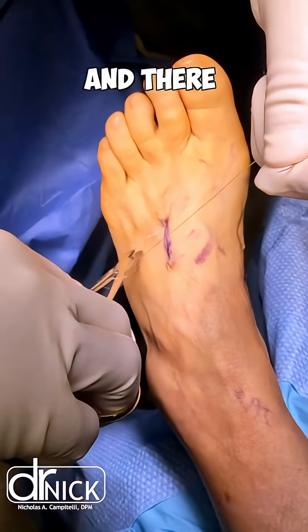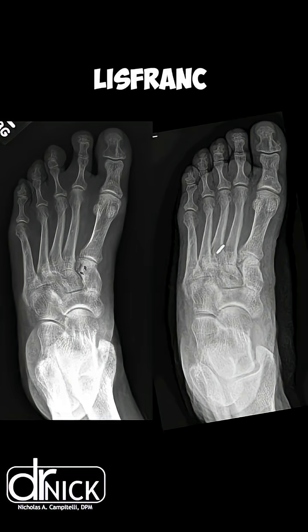We cut our internal brace and there you can see our finished product and the repair of the Lisfranc ligament.